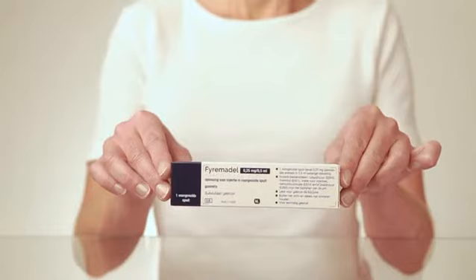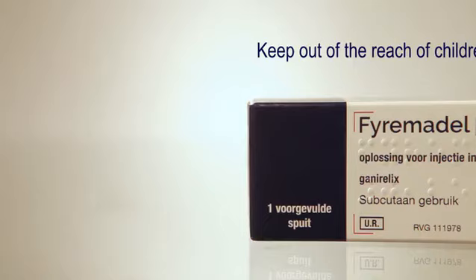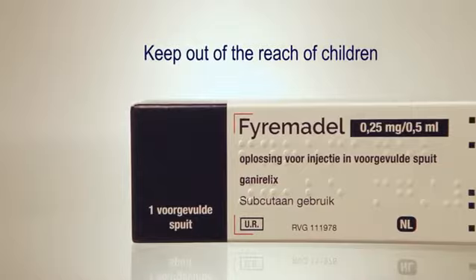You and your doctor have agreed that you will start using Fyremadel and when you are going to start the injections. Fyremadel does not need to be stored in the fridge. Keep Fyremadel out of the reach of children.